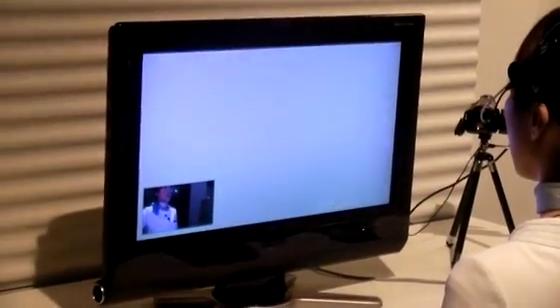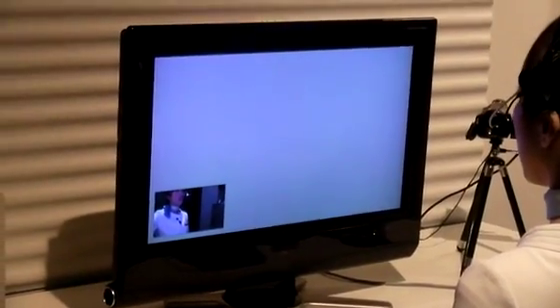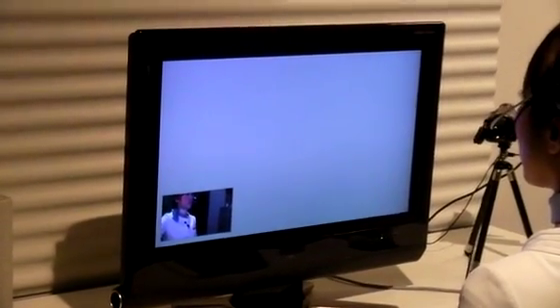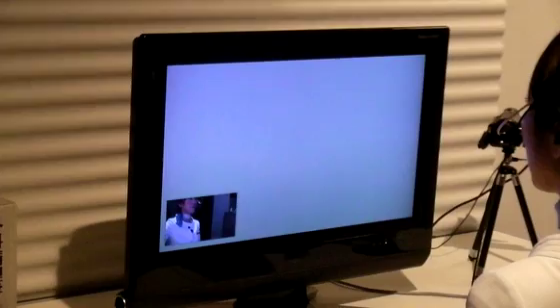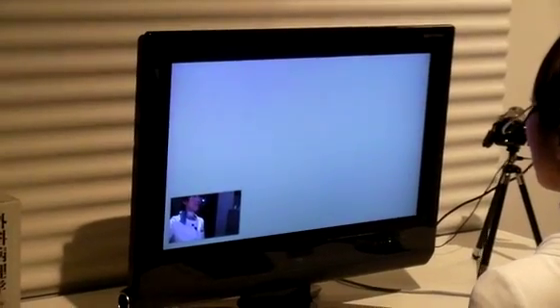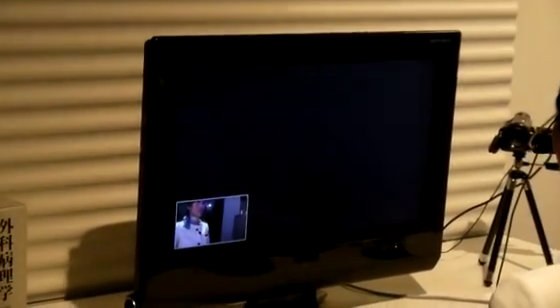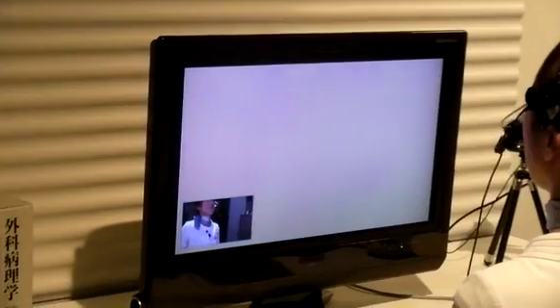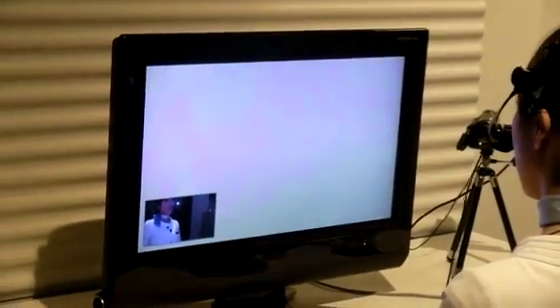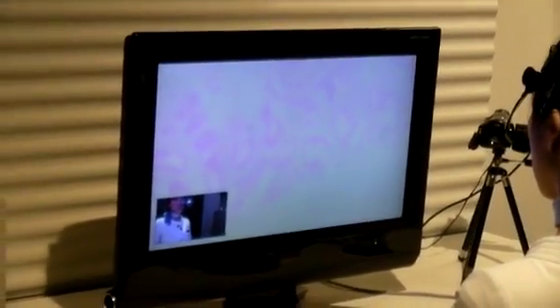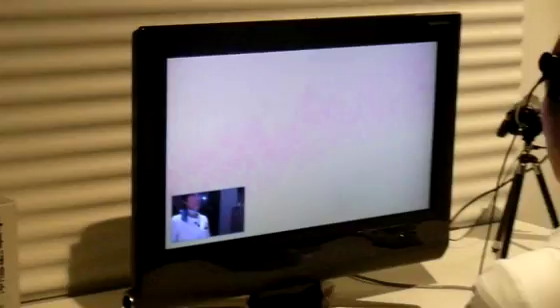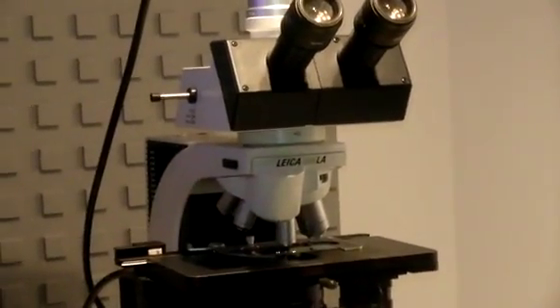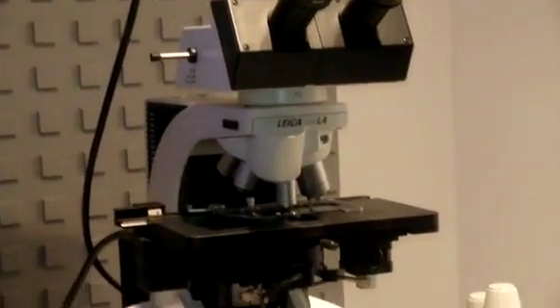Zooming in, out, and we can also adjust the focus. Just like this. For example, to check if cells are cancerous, a doctor located far away and a university pathologist can both look at the same high quality microscope video for a fast and accurate diagnosis.